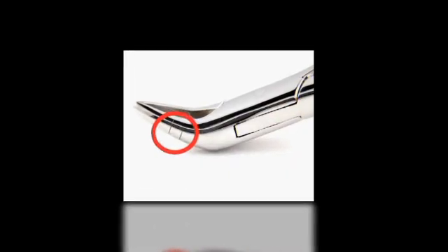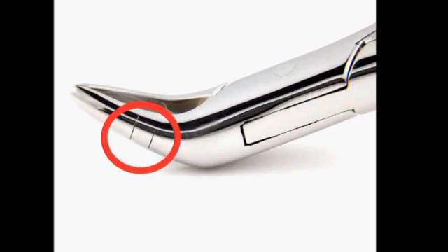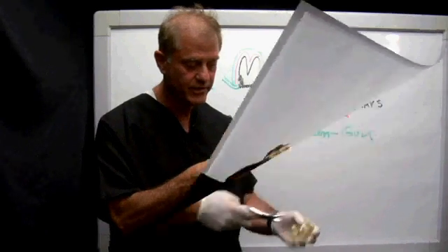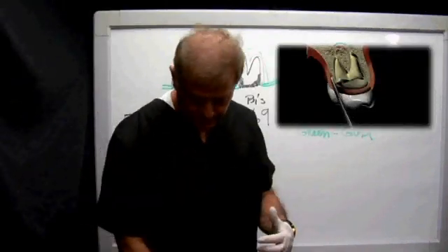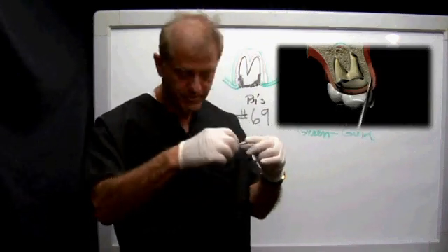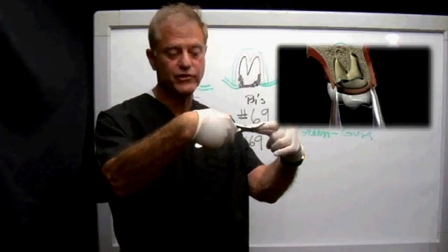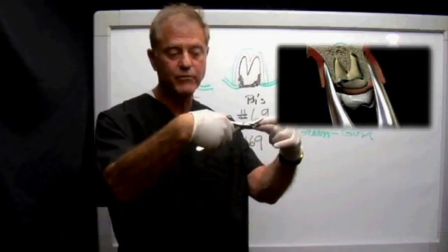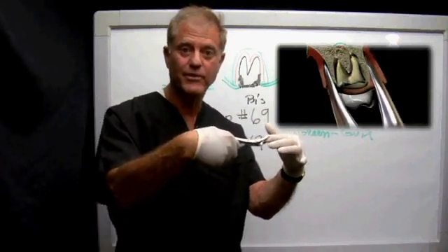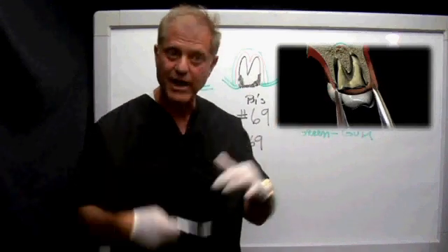The elevators are an exact duplication of the ends of the forceps. So once you've taken the buccal and the lingual elevators, you replace it with the forceps. What I'm trying to do is slowly take the elevator, push up, take the elevator, push up. Then I take the forceps and go where the elevators were. I never squeeze this instrument — I'm just doing a wrist movement, then move it up, go like this, move it up, and you will start to see the remainder of that tooth, whether it be the root or half the tooth, start moving in a vertical direction out of the socket.